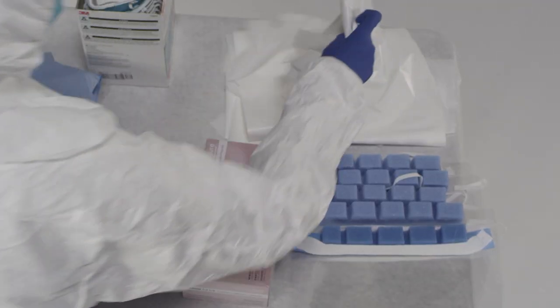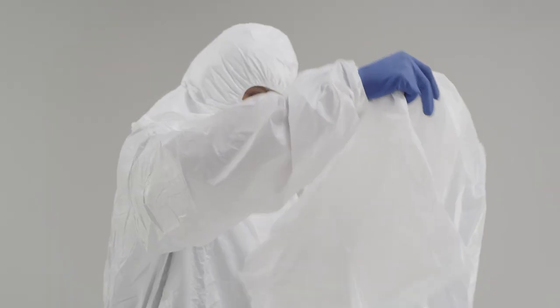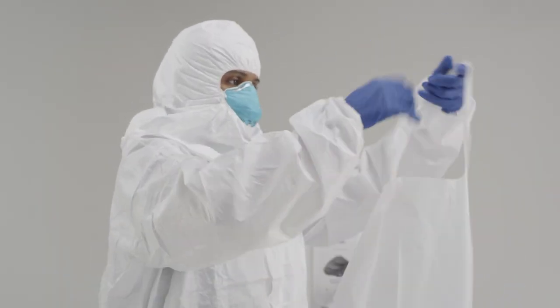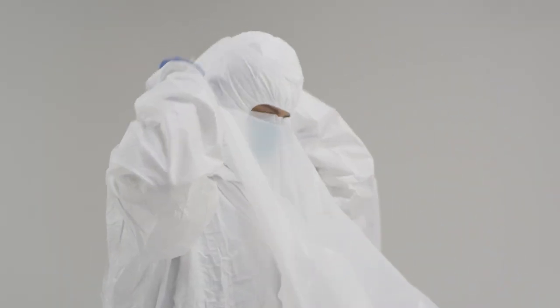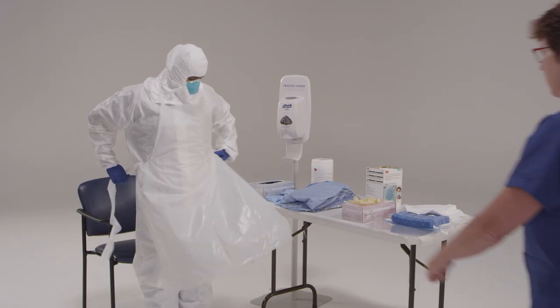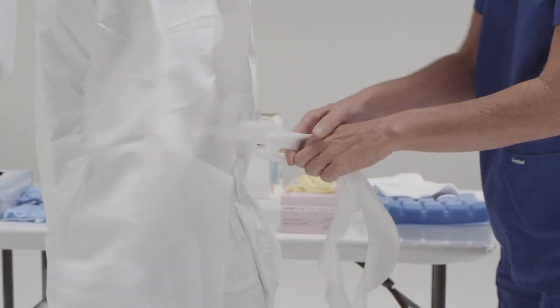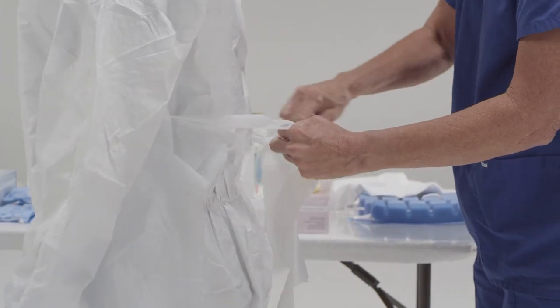Now we're going to put on the apron. We're going to take the apron, put it over our heads methodically and slowly, and then we're going to tie it around the back. If the patient is having vomiting or diarrhea, put on a single-use, fluid-resistant, or impermeable apron that covers the torso to the level of the mid-calf. The apron provides an additional layer of protection to the front of the body against exposure to body fluids or excrement from the patient.